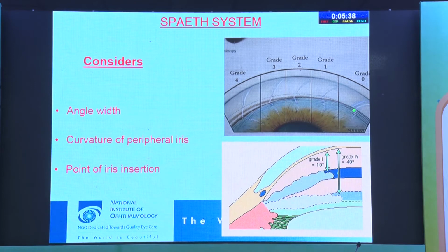you can see that this corneal wedge is coming together from the posterior and anterior side. So even Schwalbe's line is not visible. So this is a closed angle. So this generally explains it nicely, and this is what is most commonly used.